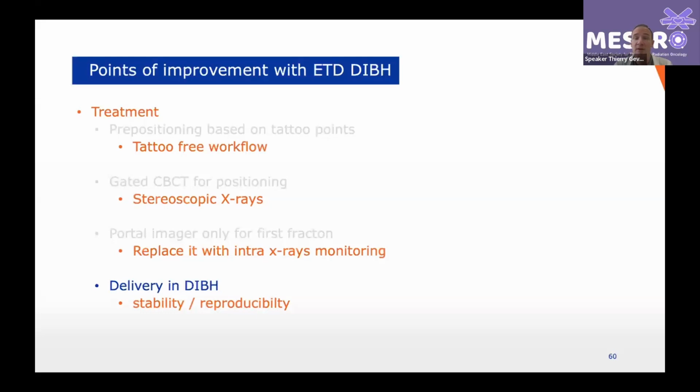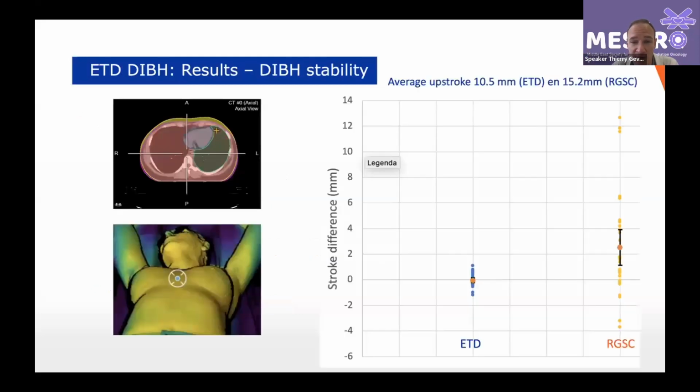And that's the most important part, because once your patient is well positioned, you want to treat the patient. The important question now is: are the breath-holds always at the right spot, and are the breath-holds stable? Because if not, the heart can be positioned anywhere when the patient is performing the breath-holds. As I mentioned, the alignment is purely based on simulation, so on the contour of the free breathing and the contour of the breath-holds. With that information, the system calculates all the time where the patient needs to hold the breath. We see that with the new device, because it uses information from the past, from simulation and from dosimetrical information, the uncertainty and the reproducibility are much smaller now.